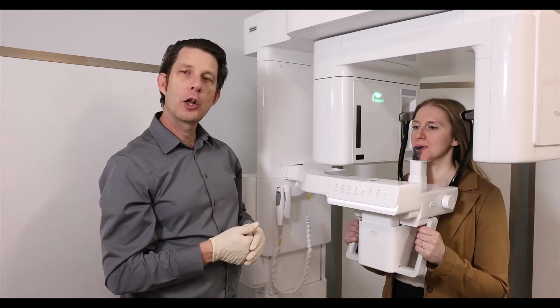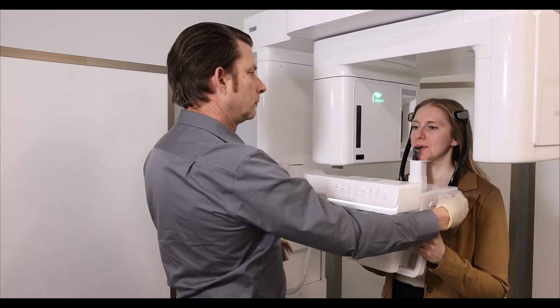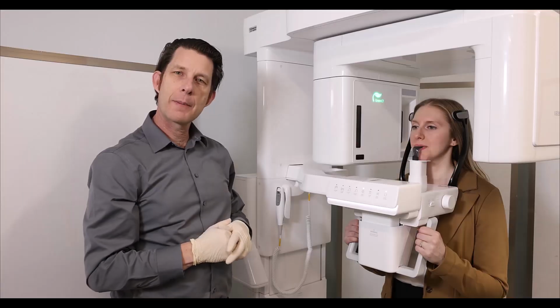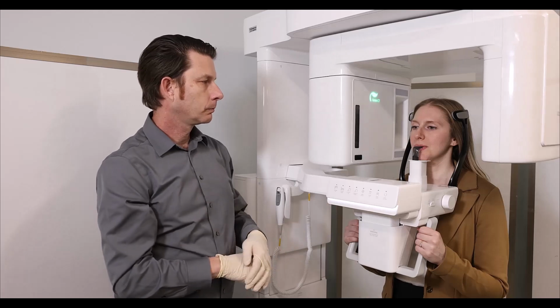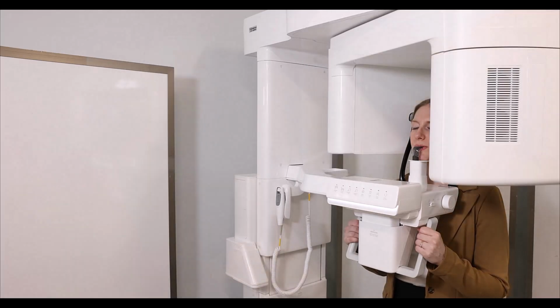Now I'm going to go ahead and close my temple supports. We're going to double check our mid-sagittal beam. And now we are ready to take and capture our image. I'm going to click our Ready Return button and we can capture our image. The system is moving into image capturing position. Please wait. The system is ready to capture an image.